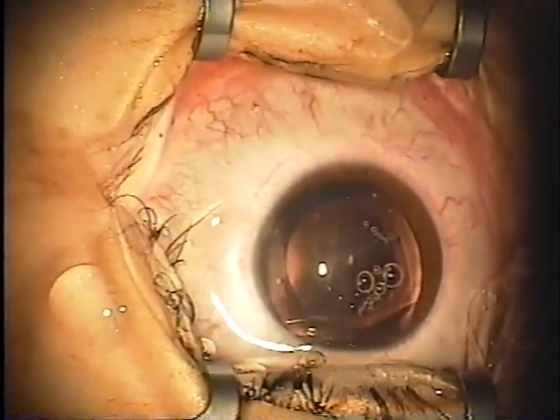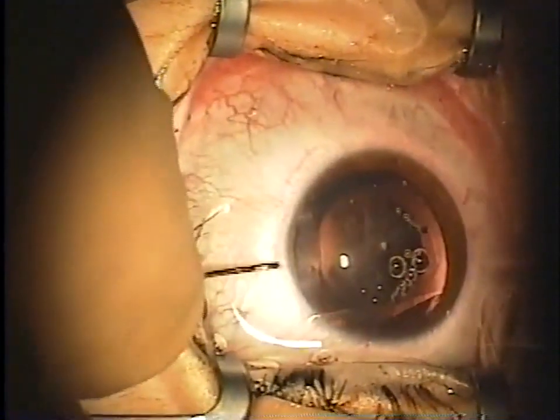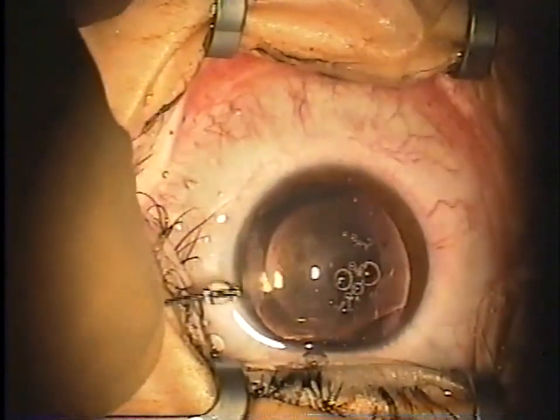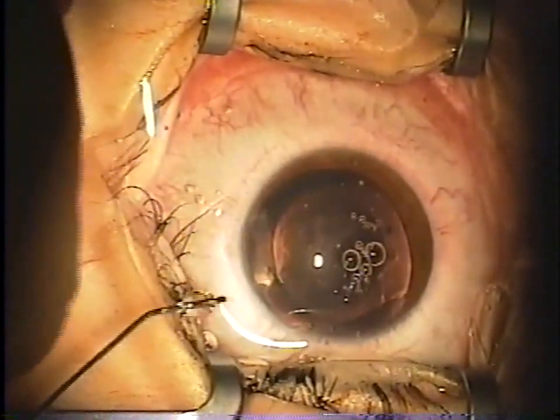You don't need a lot of Miostat. In my experience I diluted 0.1 to 0.9 of BSS in the syringe, and as you rinse out the OcuCoat you'll start to see that you're going to get the pupil coming down to cover up the ICL.